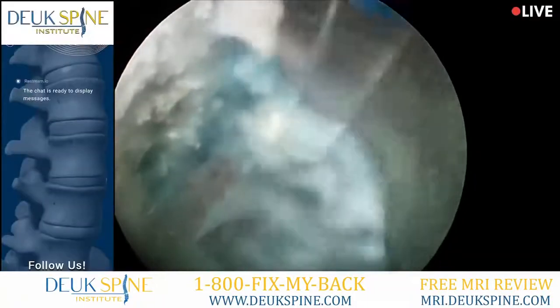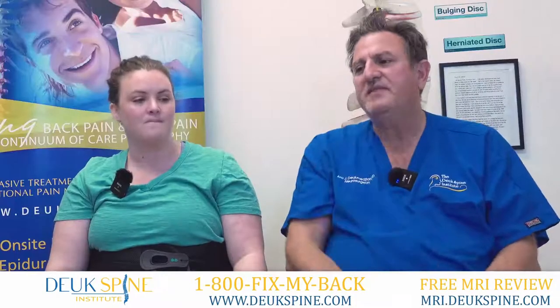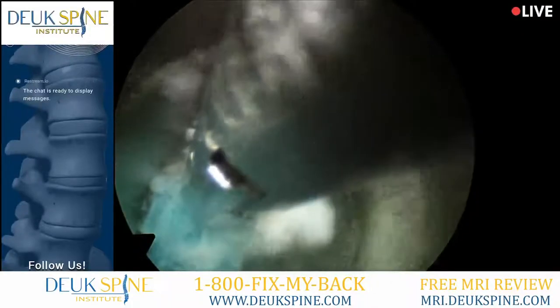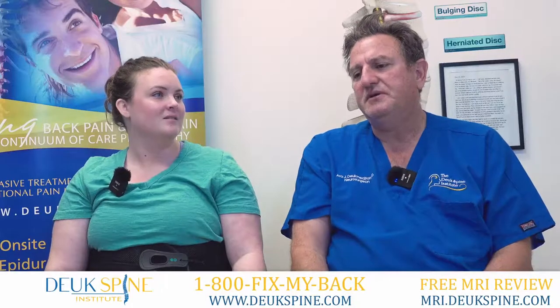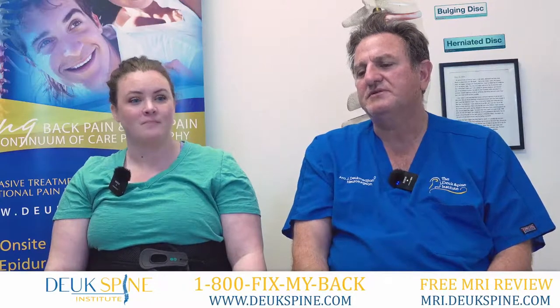Yeah. But then you'd have another herniation with activity, and then it made it worse. So yeah. When we were in there, and you can see from this video right here, we were pulling out lots of big fragments of disc herniation. You probably over your lifetime from 14 until now had at least 10, 20 different episodes of herniation. And that's what we saw when we were inside there.